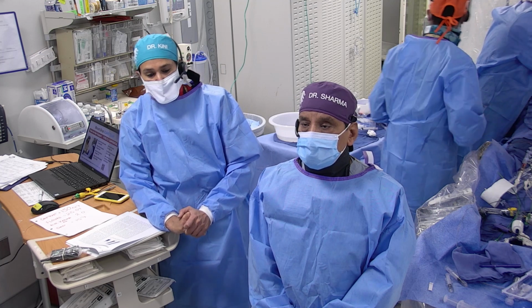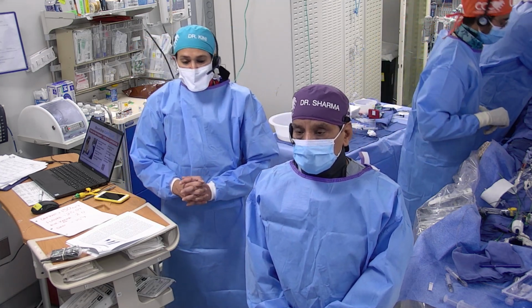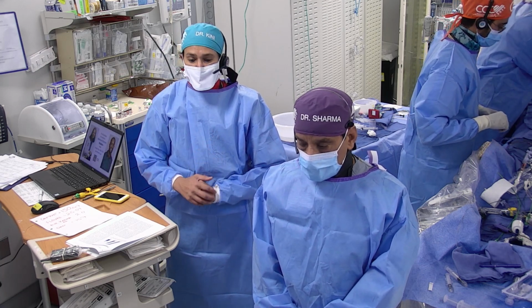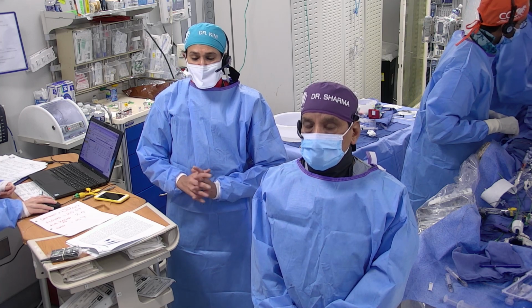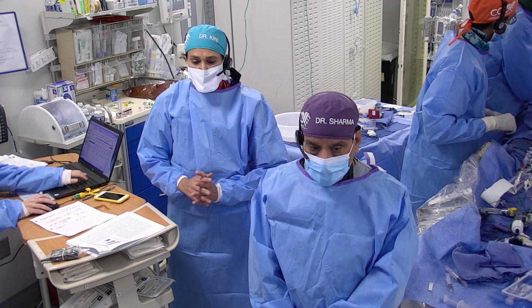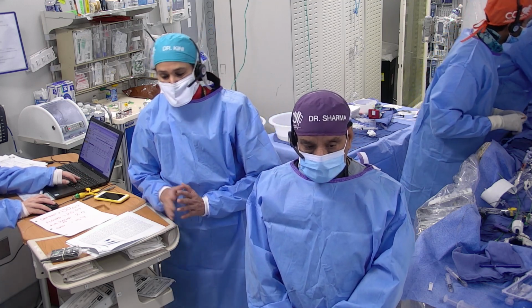If they do not go, you will have your Godzilla there with the guide, and you can use the laser. Now we know we can use a laser here since our movement of the wire was very free, and we knew there was no subintimal track or dissection that we had created.